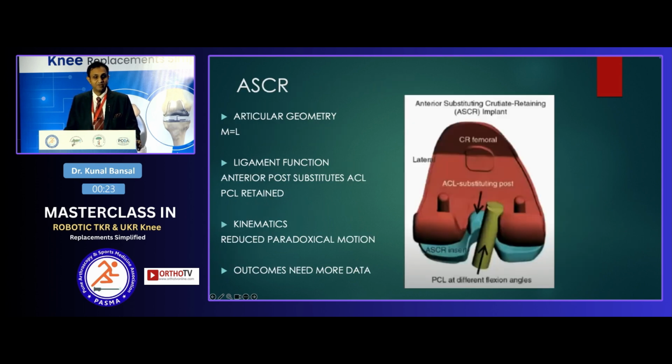The newer kind of implants, the anterior substituting cruciate retaining implant, again, medial and lateral are the same. Anterior post substitutes the ACL, so the gliding of the knee is reduced. The PCL is retained, with reduced paradoxical motion, but the outcomes need more data as these implants are newer. There's no study more than 8 to 9 years currently.